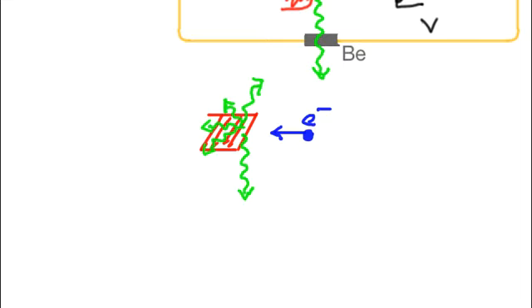Second, the electrons impact the anode in a roughly circular area. That's called the focal spot. The size of this focal spot is an important parameter because it influences the resolution of imaging that's achievable. The size of the focal spot is dependent on the angle of the anode because you're viewing the focal spot from below. So depending on the angle of the anode, that determines the apparent focal spot, how big it actually looks when viewed down below. This is sometimes referred to as the line focus principle.